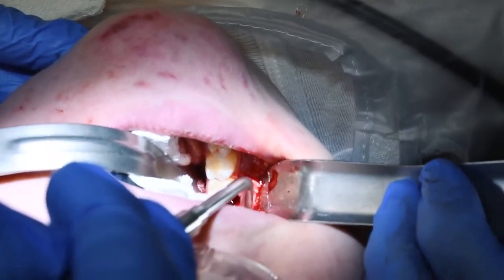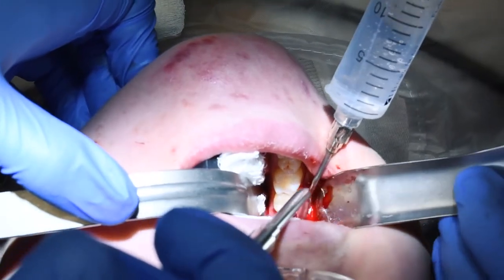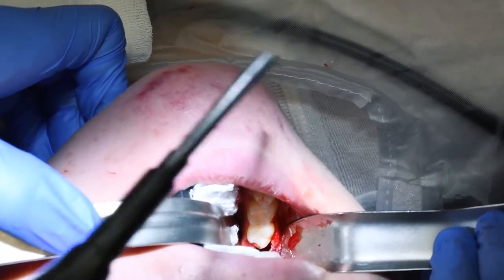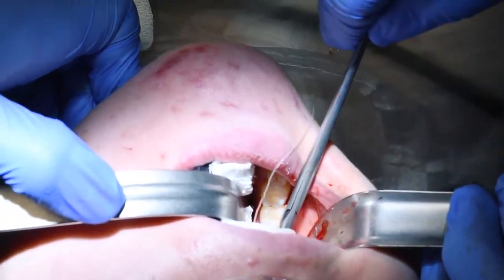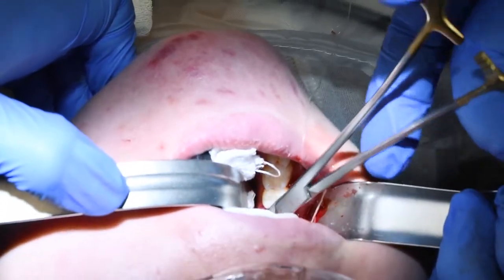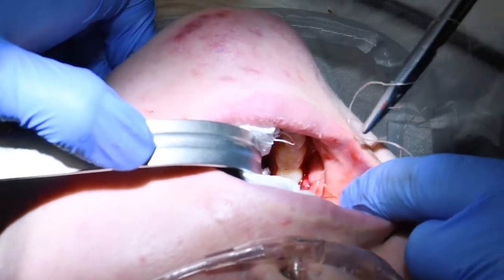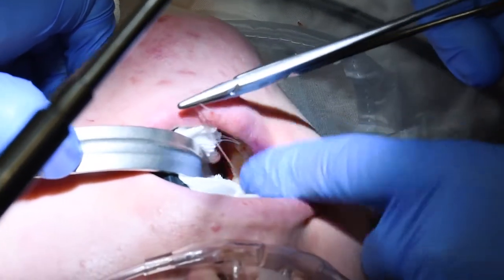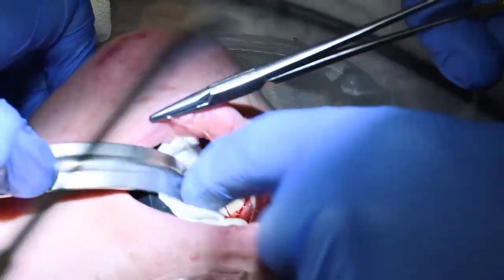Curette — you can have to breathe a lot better right there. A little irrigation, suction. We used to believe that suturing it tight would decrease complications, infections, dry sockets — but we actually know now through research that it does not decrease the incidence of those things. And if you seal it off, you get a lot more swelling and pain afterwards. So we just put a stitch in to re-approximate things, but not to create a hermetic seal.